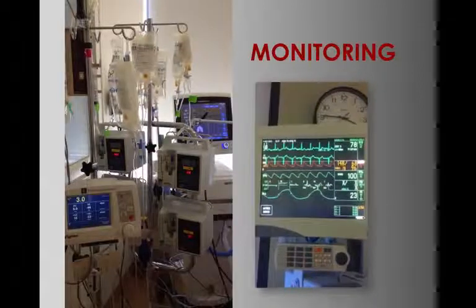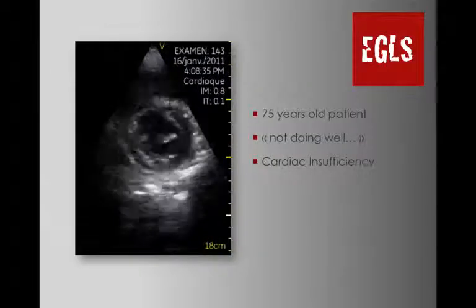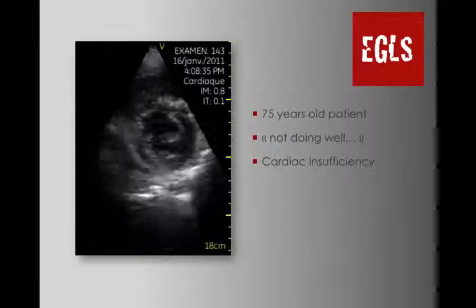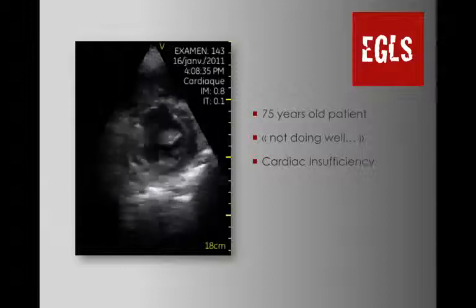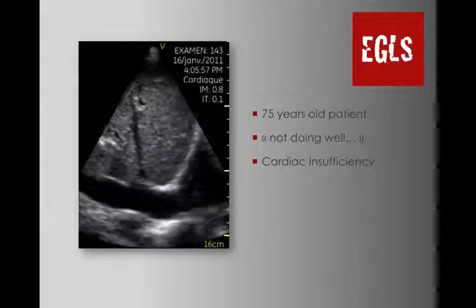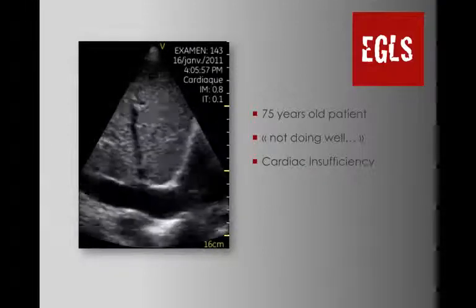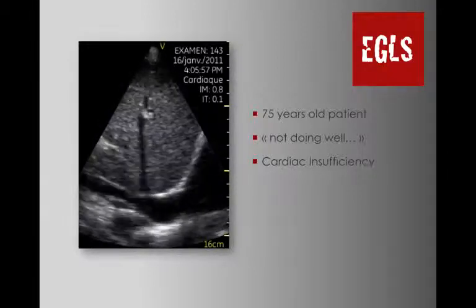So getting back to our case and why we should use ultrasound in shock, would you be scared of giving this patient more fluids, even if he's known for cardiac insufficiency? Well, his heart is certainly pumping well today, and his IVC completely collapses. He's completely empty. Ultrasound, in this case, helped us to confirm that this patient is highly likely to be fluid responsive and feel more comfortable in doing so.